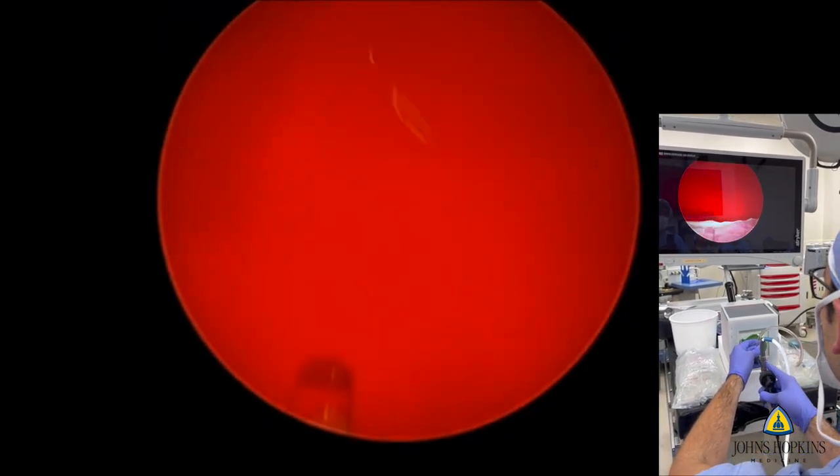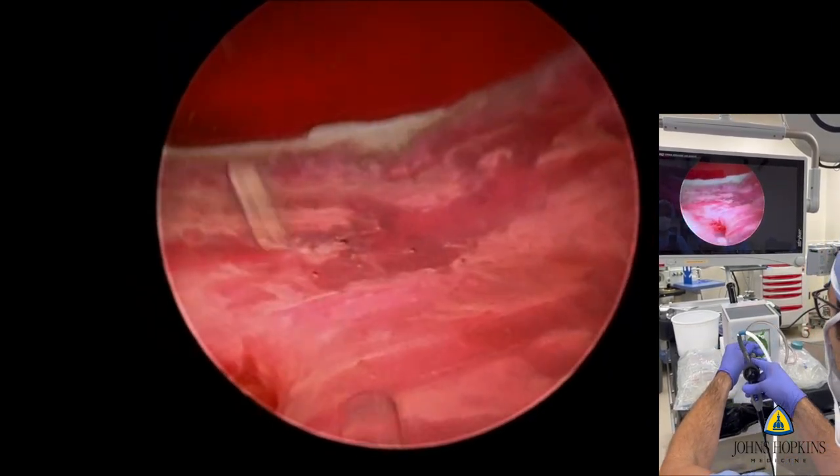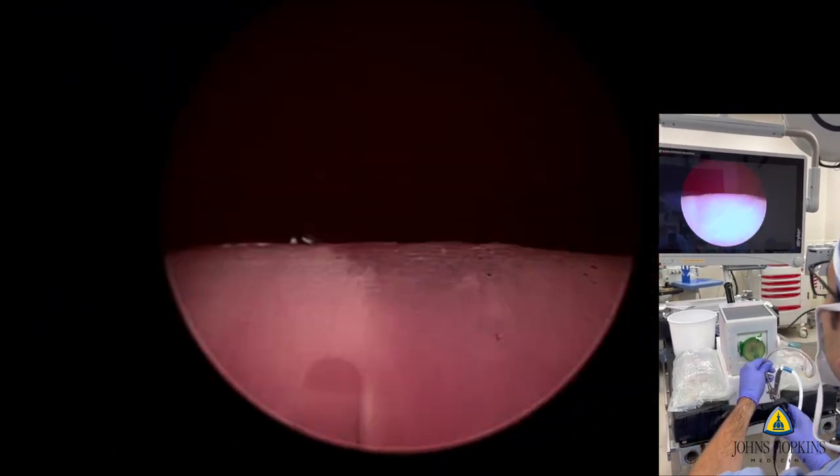Here the surgeon is looking at the left ureteric orifice, and because of the large median lobe, they have to really torque on the scope, and then they're looking at the contralateral ureteric orifice before completing their actual enucleation.